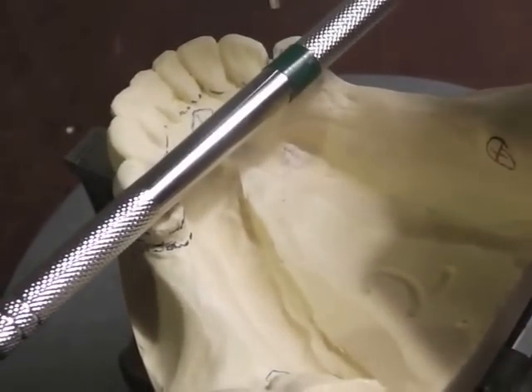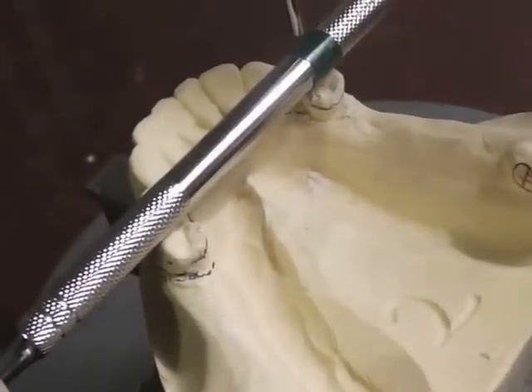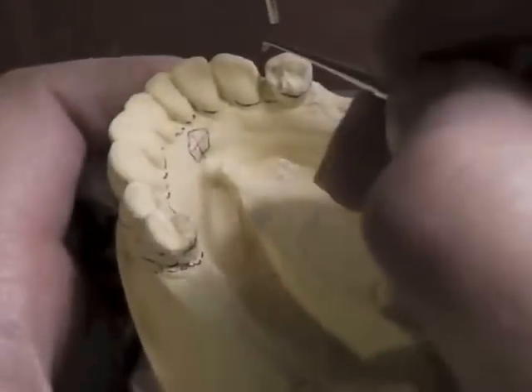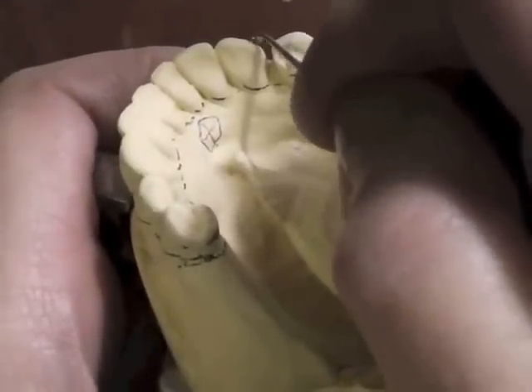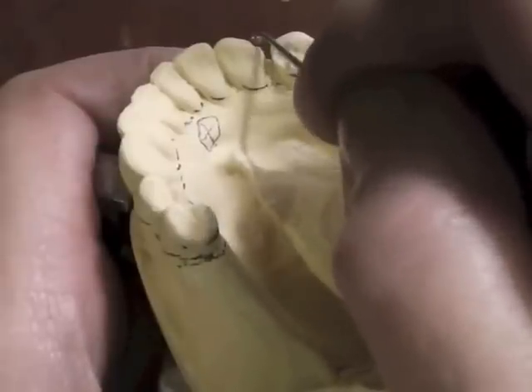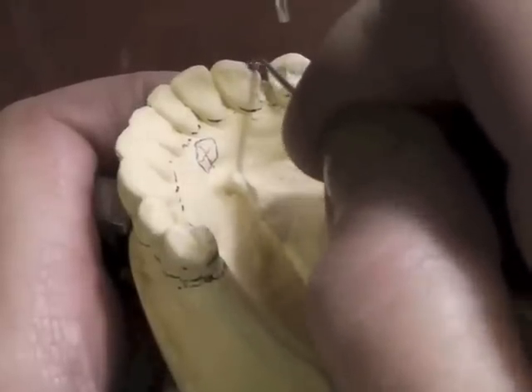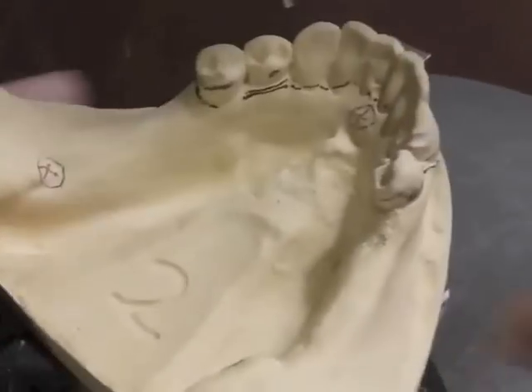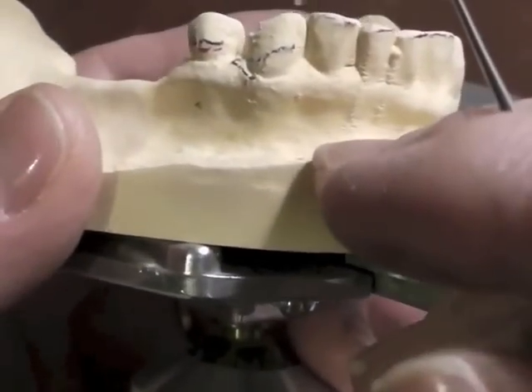One of my indirect retainers will be on the canine. We cannot place them on the mandibular incisors, so the closest place we can put an indirect retainer — which we have to have for a Kennedy Class 1 or Kennedy Class 2 — is on the canine. On Kennedy Class 1 we usually have two indirect retainers, and on Kennedy Class 2 we might have one. Our indirect retainer is going to be on a distal incisal angle rest, and I am preparing that rest at this point.